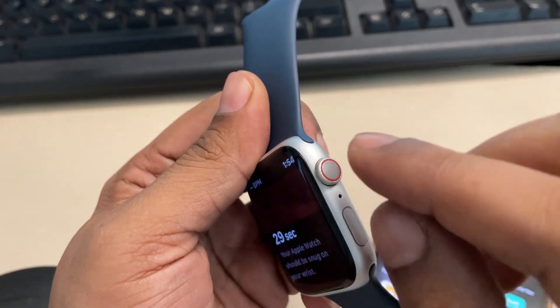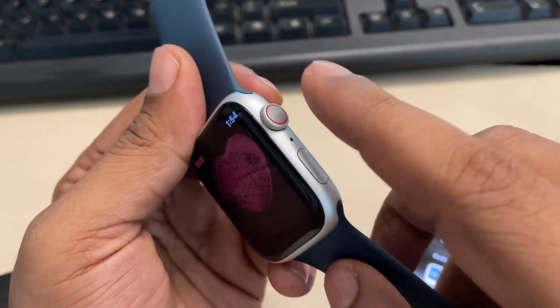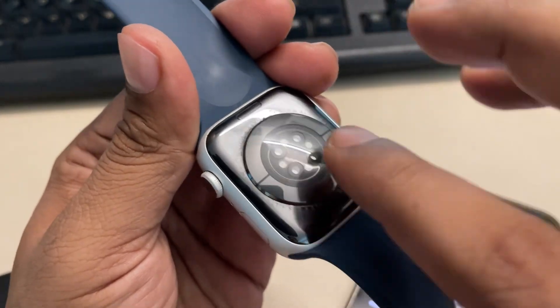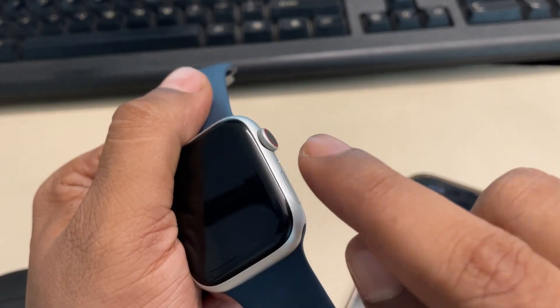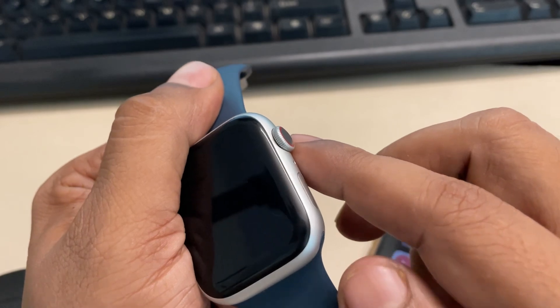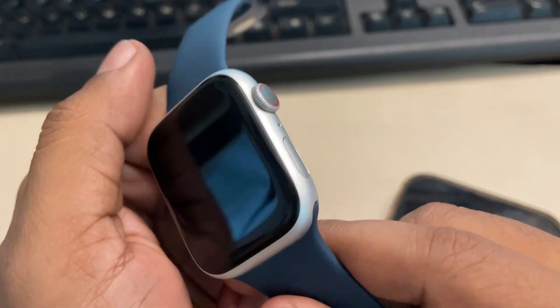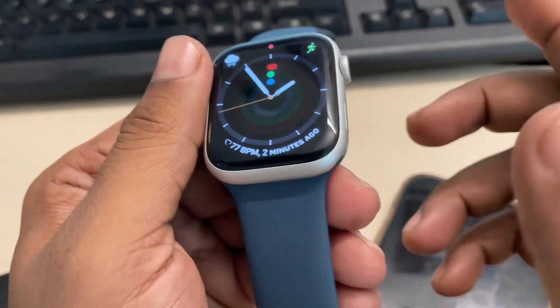If that still doesn't work, try cleaning the crown by wiping it with mild alcohol using a cotton pad — do not use too harsh an alcohol. Also clean the back area of the watch. You can also try blowing some air into the crown, as dirt can get stuck there and make the ECG reading process difficult.